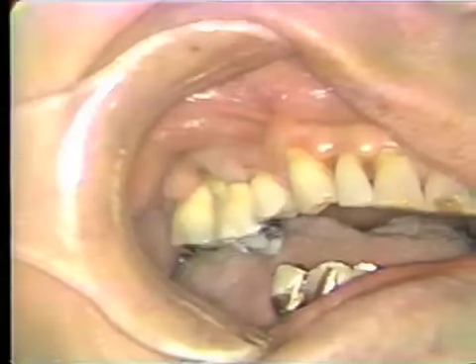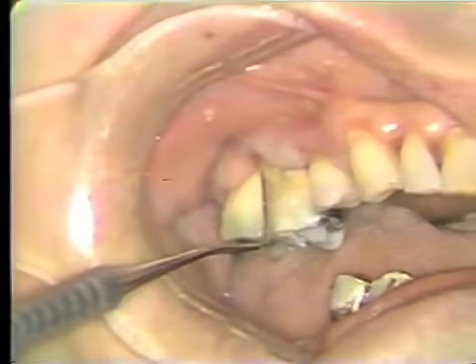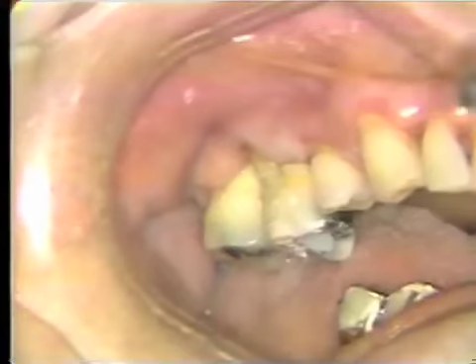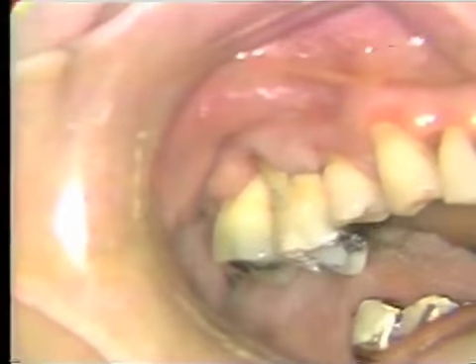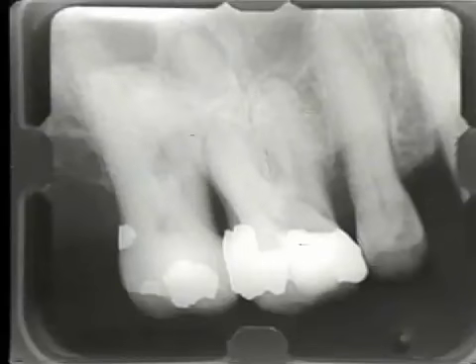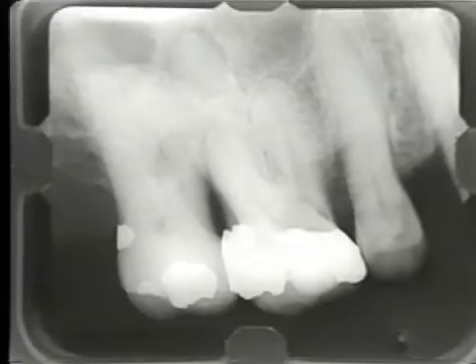Clinically, in our patient for today, we can see tooth number 3, where there is severe alveolar bone loss of the distal buccal root. Looking at the radiograph, again we see bone loss of the distal buccal root. However, the lingual and the mesial buccal roots both have good bone support.